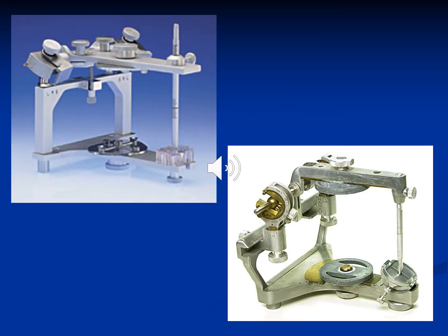Now we have a huge variety of articulators available. Like you have many mobile phone types, you have many articulators, but there is an element of cross learning between them. There is similarity that you can use for your convenience to use a different tool based on your experience with another one. For example, here we have two semi-adjustable articulators. The upper one is an arcon articulator because the condyle is in the lower, while the right photo is of a non-arcon articulator because the condylar element is on the upper. Again, we can see that the condylar element can be adjusted according to horizontal and lateral condylar guidance angles. Also, the intercondylar distance can be changed here, to conform more to the patient's condition. All these similarities are aiming at a single objective, which is to have an accurate reproduction of maxillomandibular relation.